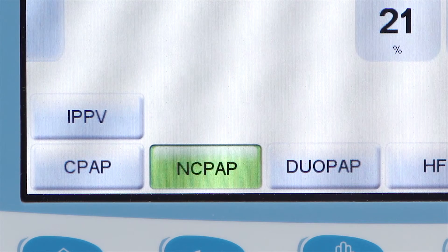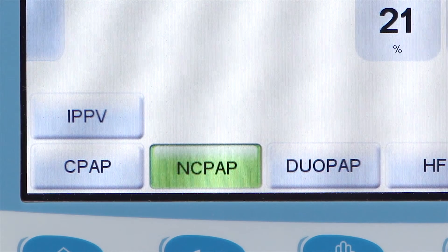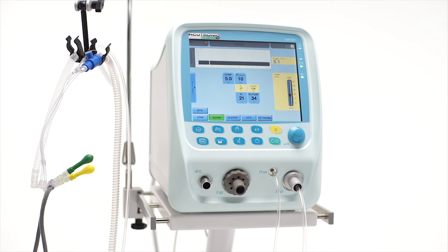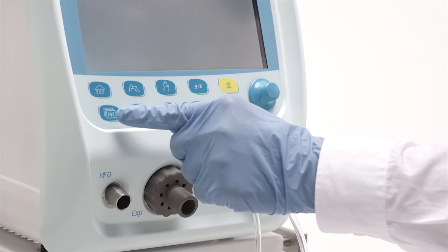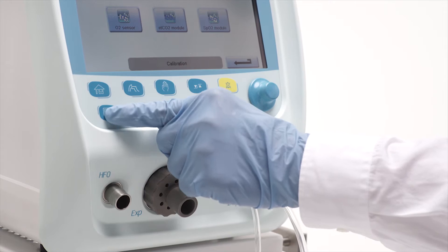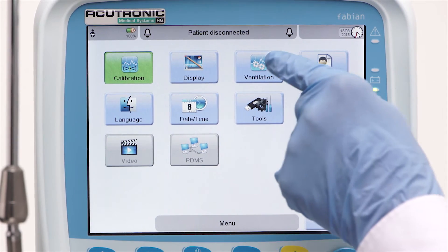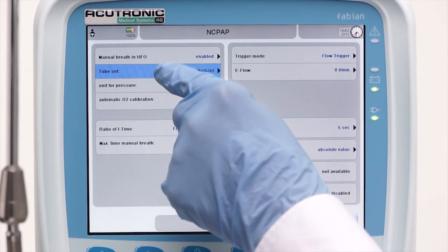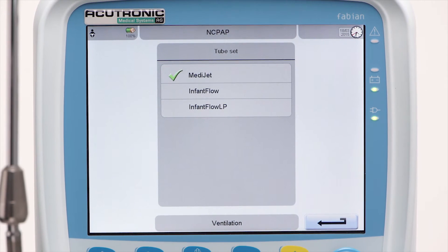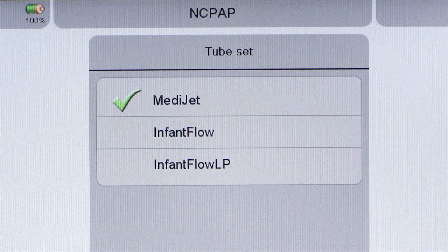NCPAP is a non-invasive CPAP mode to be used with variable flow generators. To check or choose the desired generator, press the menu button twice. Press the ventilation button followed by the tube set button. Select your preferred generator system from the list: MediJet, InfantFlow, or InfantFlow LP.